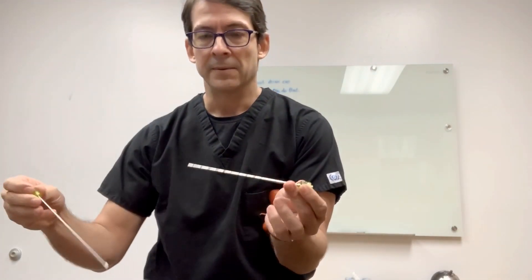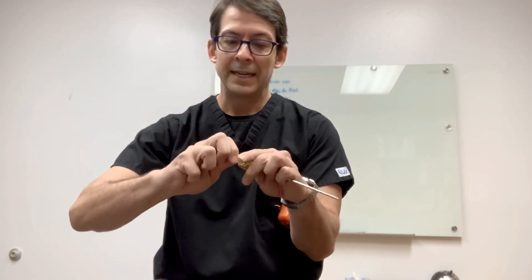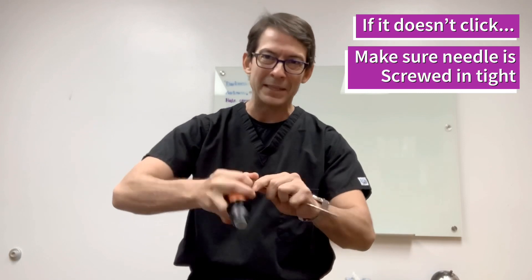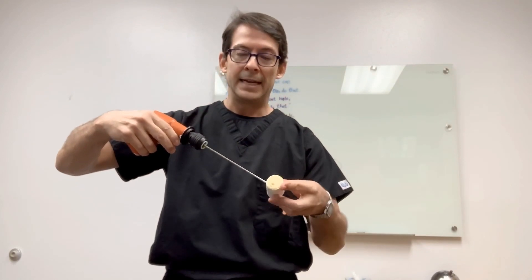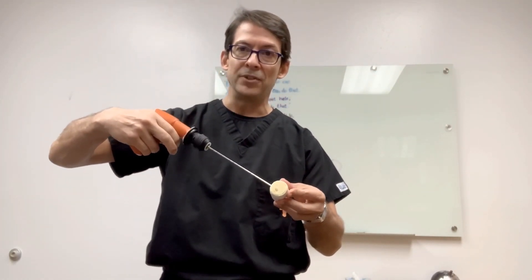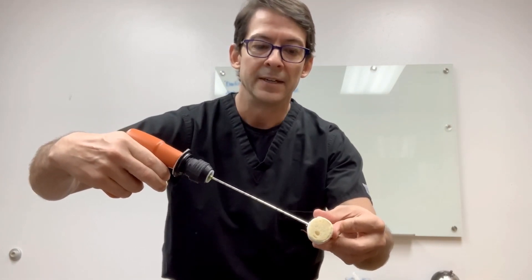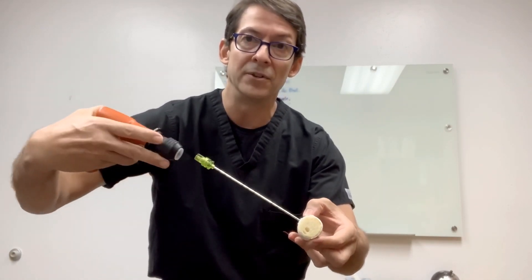The coaxial needle is hollow and has the diamond tip needle inside, which is the one that breaks through the cortex. It screws in and has to be completely tight for it to click. A lot of the time when you're starting it doesn't click, and most of the time it's because the needle isn't completely screwed in. You need to hear that click. Once you're at the bone, you start drilling first, gauge how hard or soft the bone is, then push forward. Once you pass the cortex, you have to pull the adapter back and release — otherwise you'll take the needle outside with it.